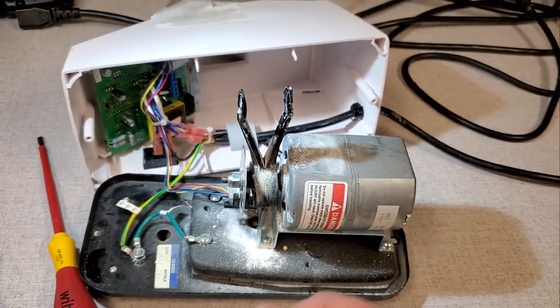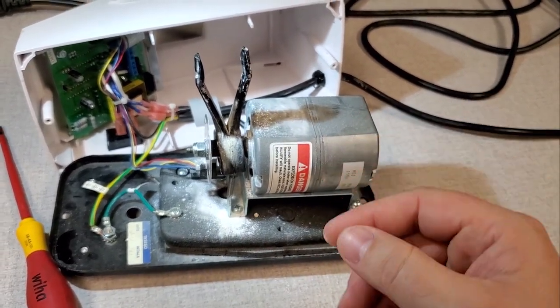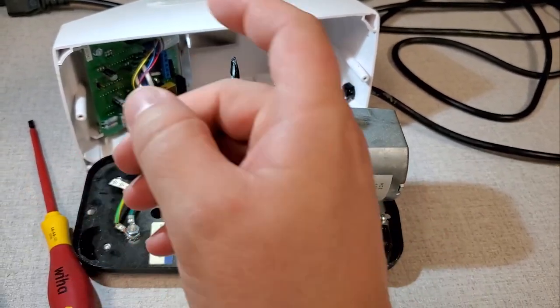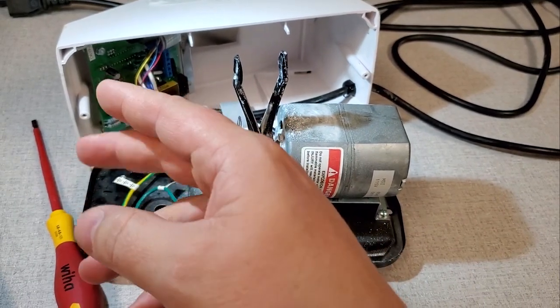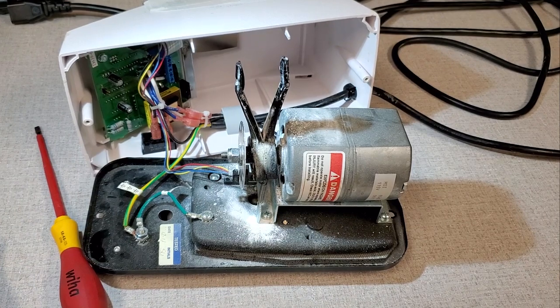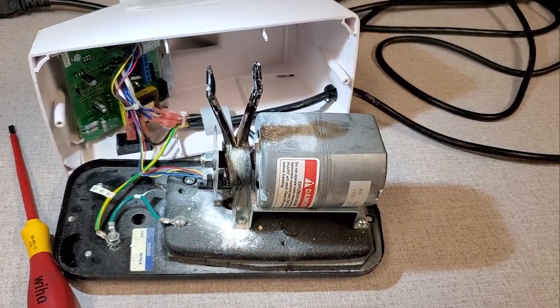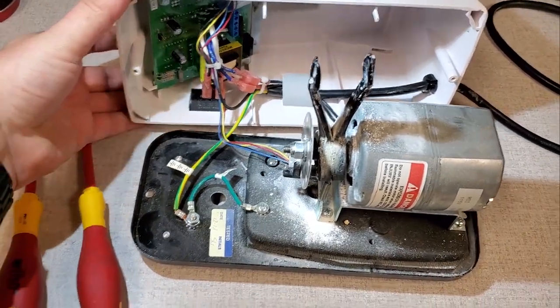So this unit here runs off of AC, and could technically run off of DC since it's a universal motor, but it's a very simple circuit of how the electricity comes in. It converts a little bit over to DC, only enough to flip a switch or set the timer for the switch flip, and it turns on the AC to this motor, which runs it, shakes the little thing right there. I'm going to go ahead and turn it on so you guys can see what it does.